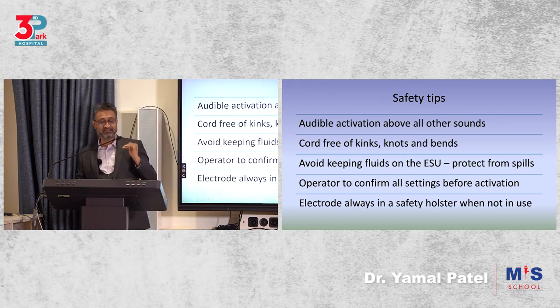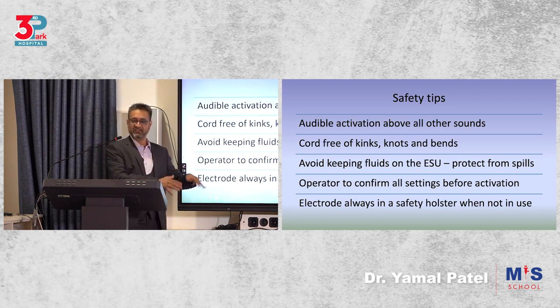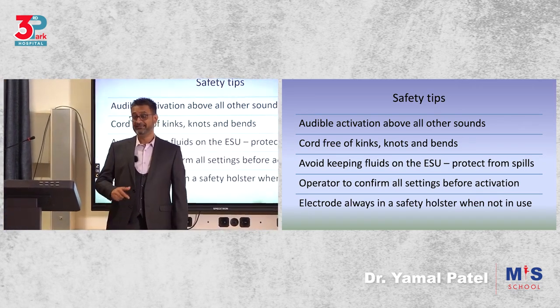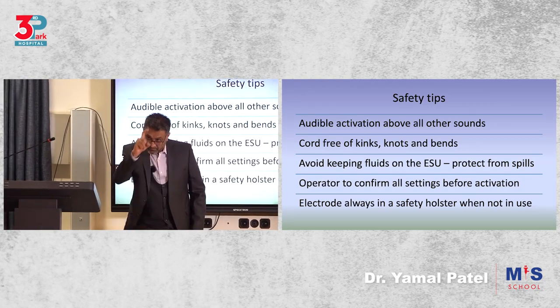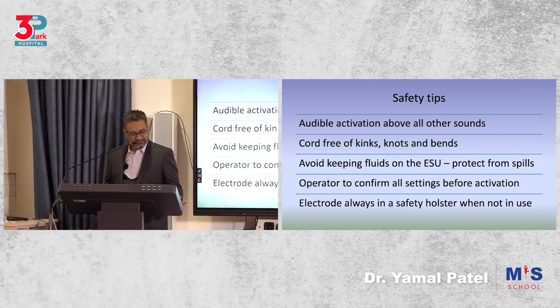The operator must confirm all settings himself or herself before activation. The electrode should always be kept safely in a holster. Don't put the electrode on the patient's thigh or on top and keep on working like that. Because if you activate by mistake with a monopolar hook, it will burn the patient without you knowing, for sure. Trust me, that's very dangerous.